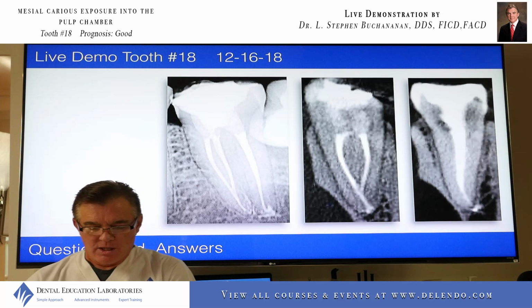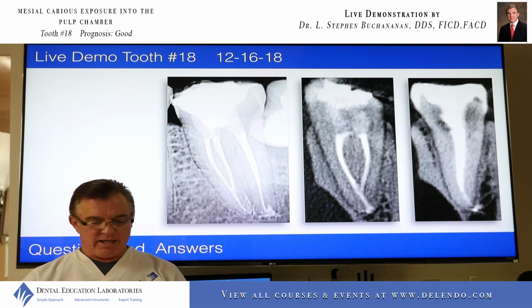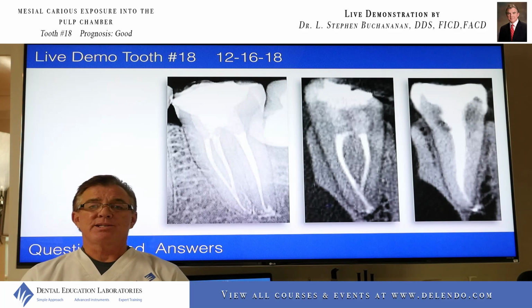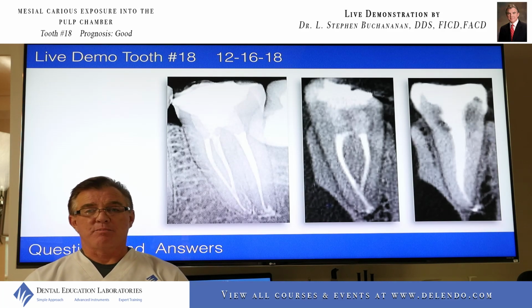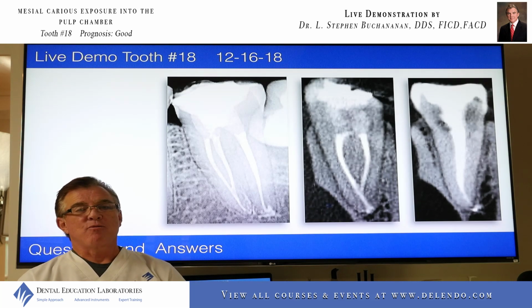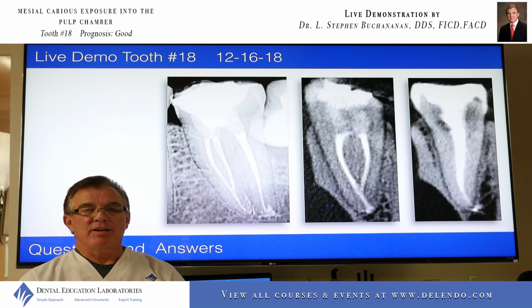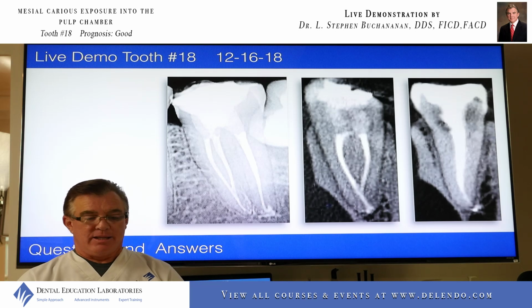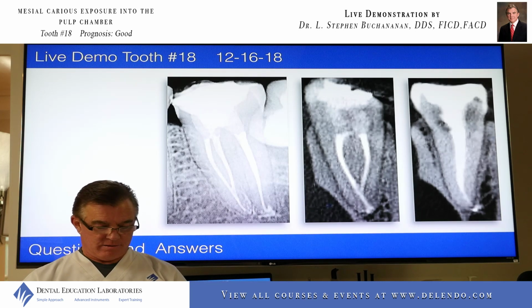Next question. How to use GentleWave when you can't find a canal? I just basically described it to you. I'm going to cut an access. I'm going to find all the canals possible. If I'm frustrated, I'll go ahead and build a platform, do the first minute and a half distilled water, leak test and wash, and hope that that's going to open the canal.